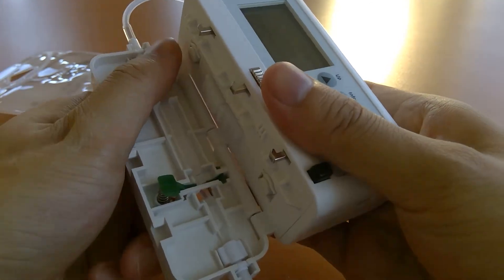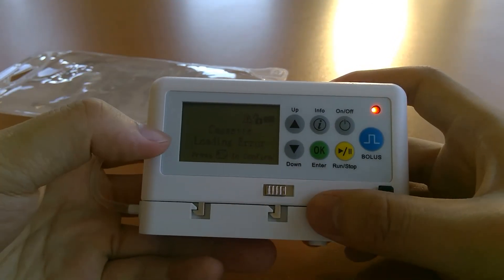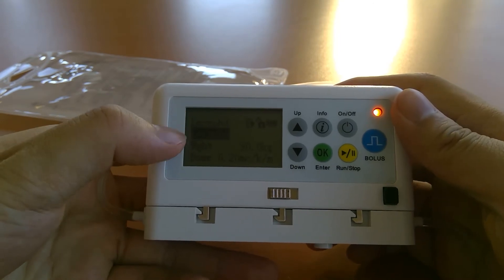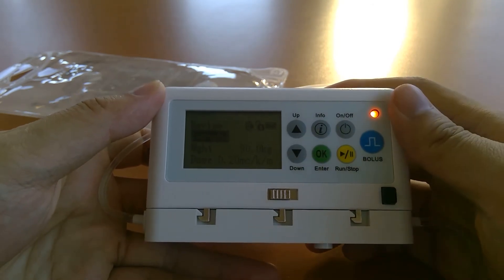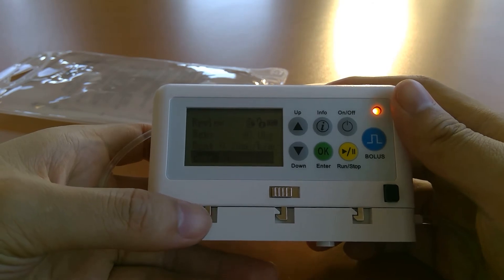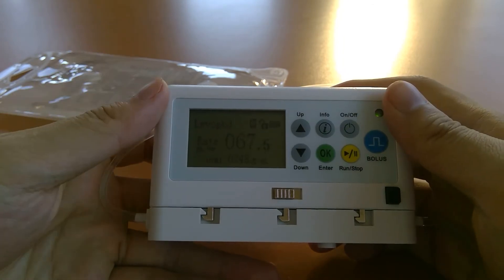The pump gives you a chance to fix the error. Pressing run/stop silences the alarm so you can debug in silence. Pressing it again shows the infusion parameters from when it errored out, so you're basically resuming the infusion. Press run/stop again, walk through the review, press OK to confirm, and the pump will resume.